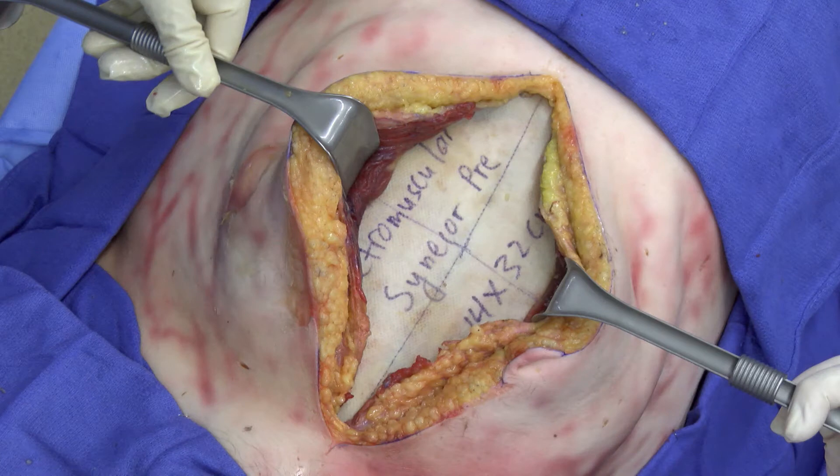This was a cadaver video demonstrating Gore Sinecore preperitoneal biomaterial for retromuscular repair.